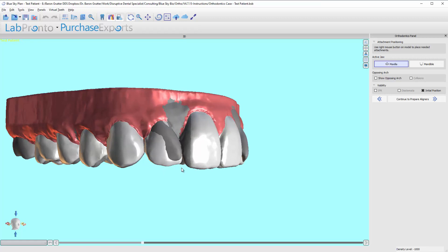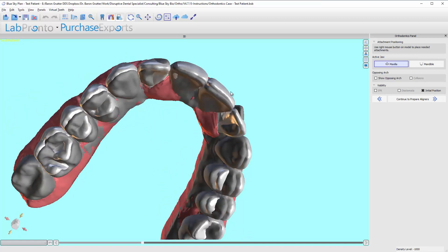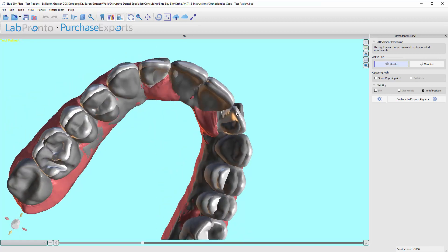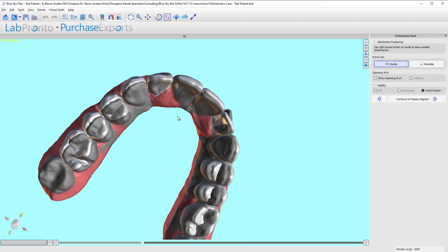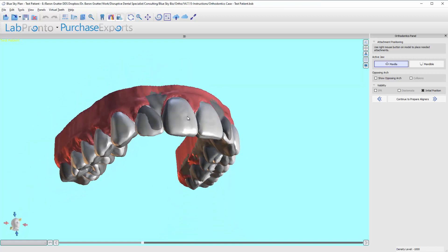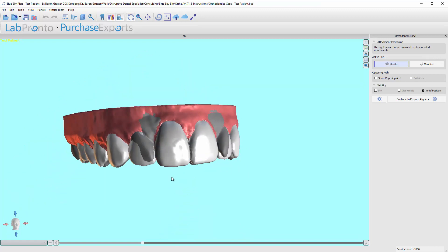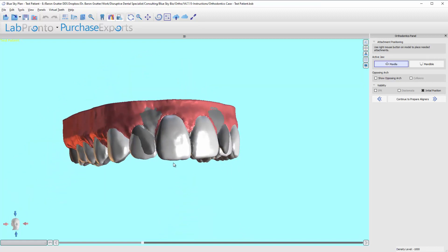I'm just going to right click on this tooth. So let's just look. These two lateral incisors are rotating quite a bit. In this case, that's pretty much the only teeth I would add buttons on.